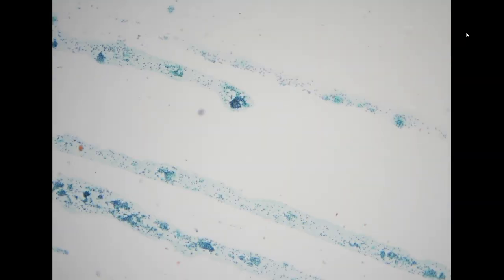We have three very interesting Pap smears today. The first specimen is from a 63-year-old female. She was noted with a pelvic tumor at another hospital, so she came to our hospital for consultation.